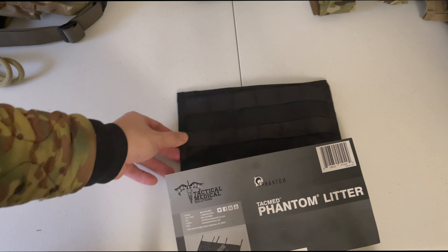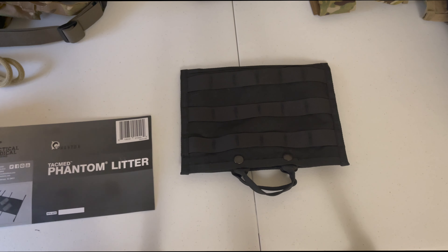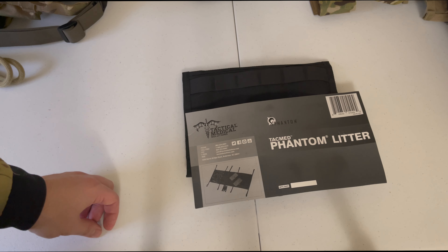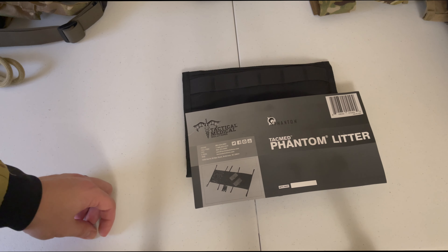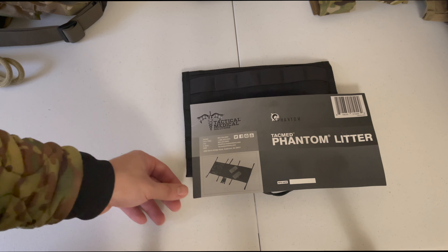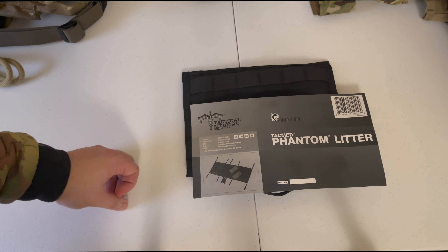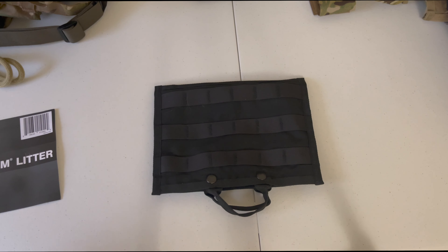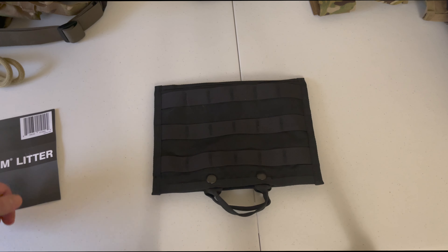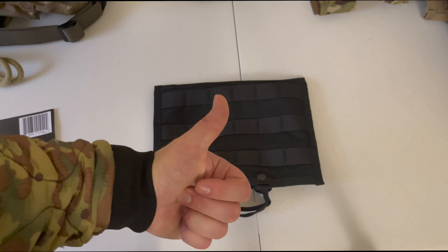I just wanted to take a quick video to show you guys this piece of equipment. If you have any more questions, reference TacMed Solutions — they will have all the answers for you. I'm just the guy putting it out there on social media and YouTube for you to see this product and go check them out. Thank you guys so much for watching. Hopefully you learned something new about what a poleless litter is and how you can attach it to your kit to be more effective as a team or squad.